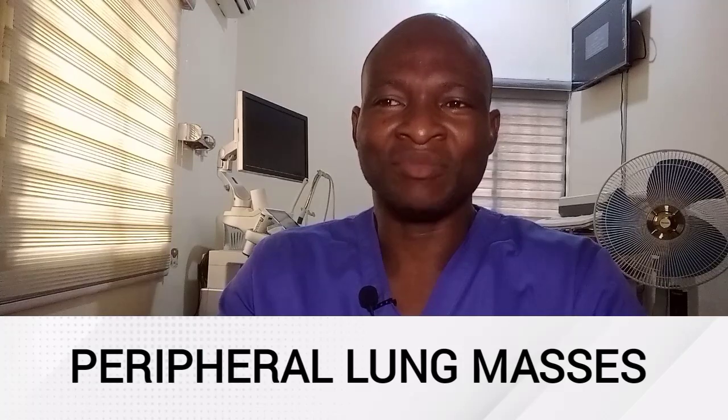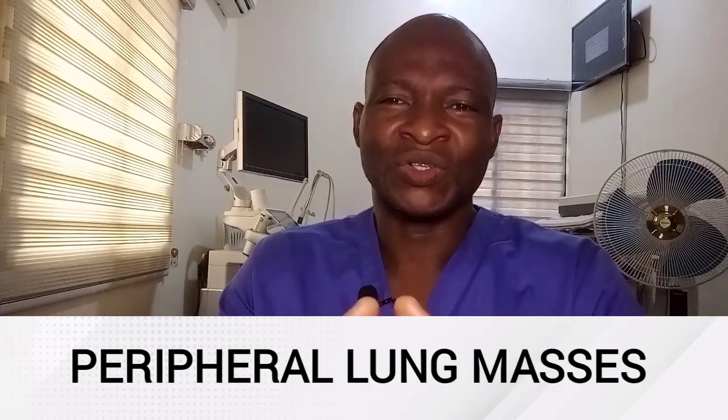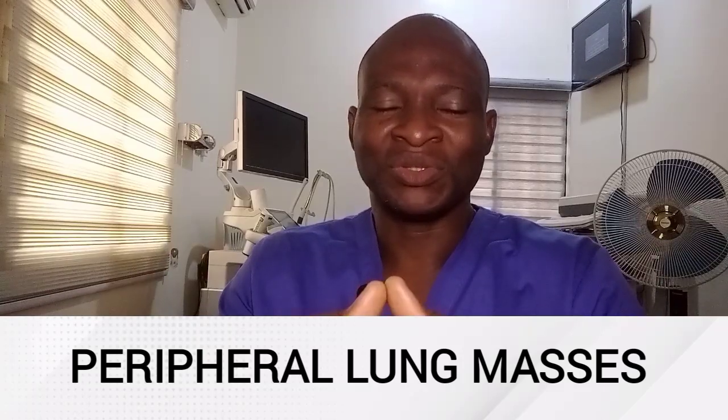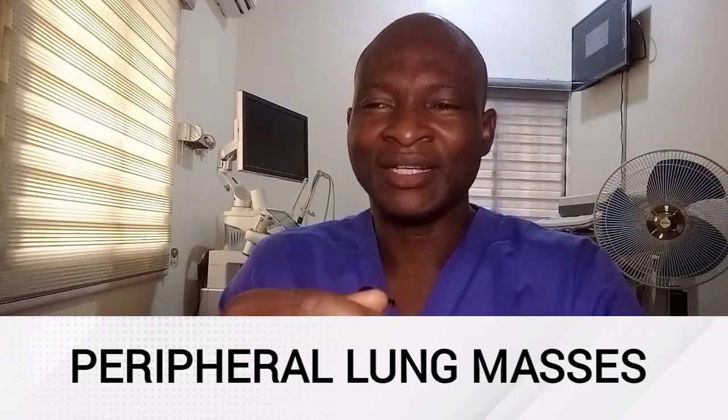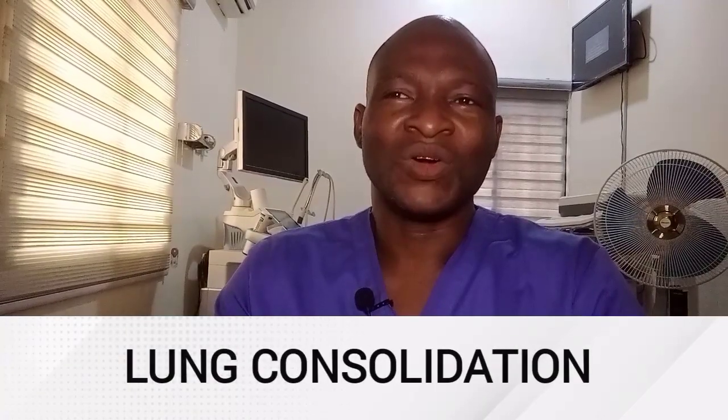Masses can be detected by ultrasound, and such masses will include pulmonary sequestration or congenital cystic adenomatoid malformations in children, peripherally located lung cancer, mediastinal tumors such as lymphoma and thymomas. Now, lung consolidation.